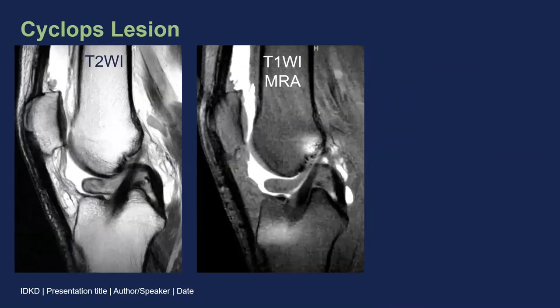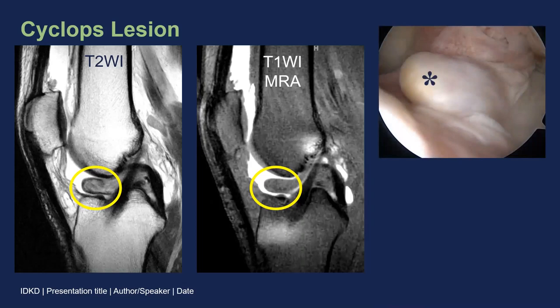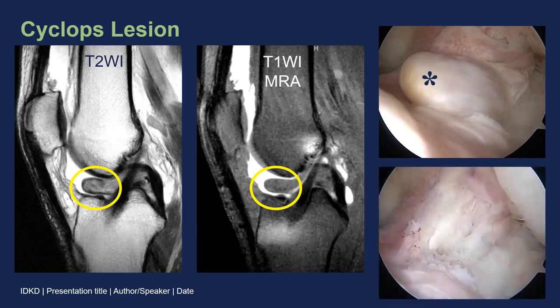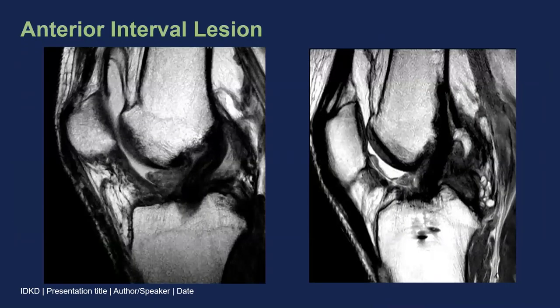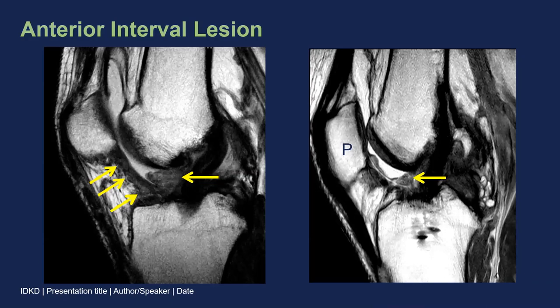Another complication to look for on T2-weighted sagittal images is a cyclops lesion — a focal synovial-based mass of arthrofibrosis anterior to the graft. It can result in limited extension, and you can see at arthroscopy why it's called a cyclops lesion: there's this eye-type structure staring at the arthroscopist, and once debrided, you can see the normal ACL fibers behind it. Arthrofibrosis can also extend into Hoffa's fat pad, called an anterior interval lesion. Both patients shown have small cyclops lesions, but also a very low signal intensity band of fibrotic tissue along the posterior aspect of Hoffa's fat pad extending to the patella. In the patient on the right, the patella is actually retracted inferiorly — patella baja — which can be another cause of limited extension and requires debridement.